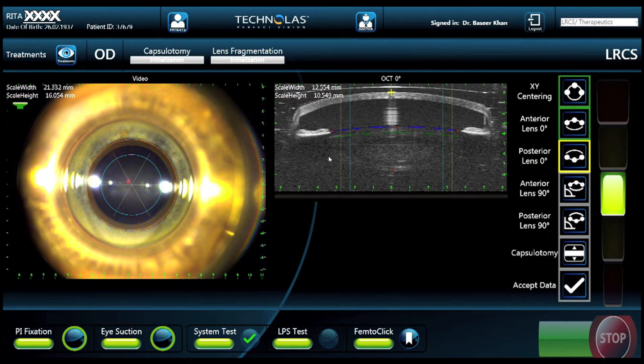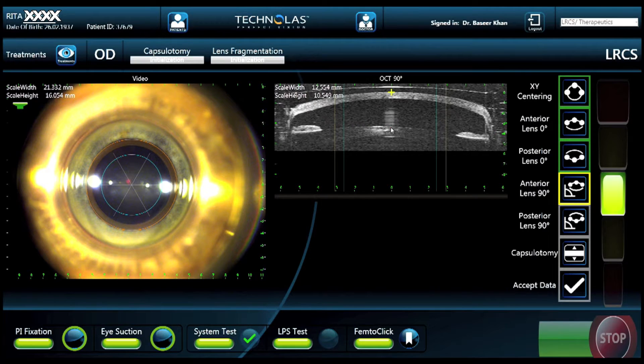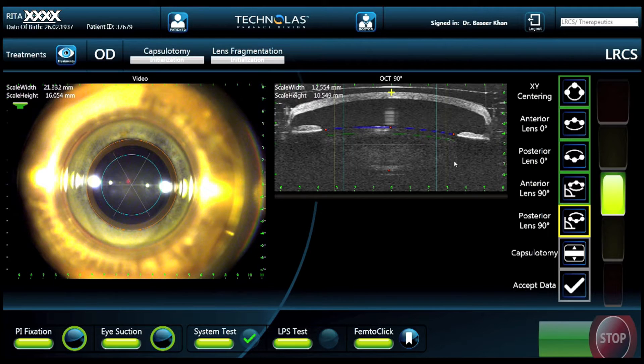When we hit the posterior button, we're able to look at the back of the lens to demarcate the posterior capsule using three points. This needs to be repeated at the 90-degree meridian as well. This allows a three-dimensional view and analysis of the lens to come up with a fragmentation pattern. The green area you see is the area in which energy will be delivered.